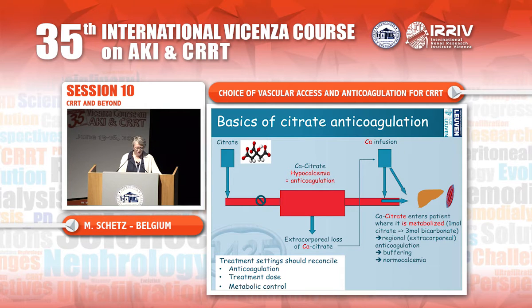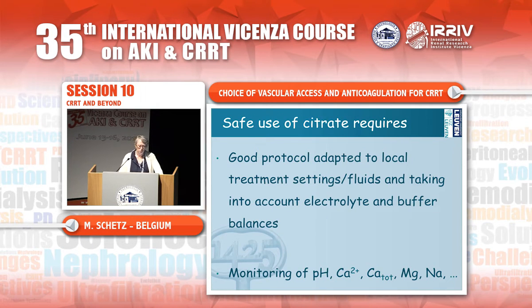So the treatment settings that you use should reconcile anticoagulation, treatment dose, and metabolic control. This will require a good protocol, and it's impossible to give you a general protocol because it should be adapted to the local treatment settings, whether you use dialysis or hemofiltration, the type of fluid that you use, and it should take into account electrolyte and buffer balances.